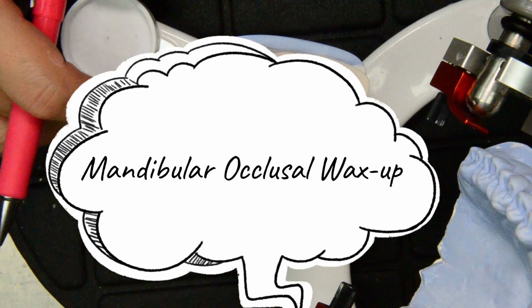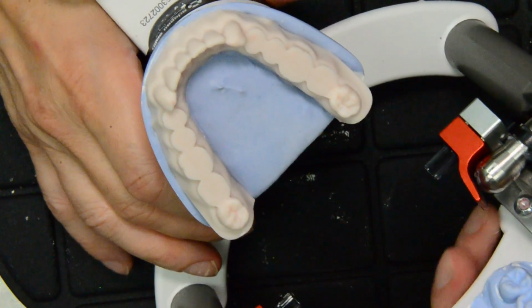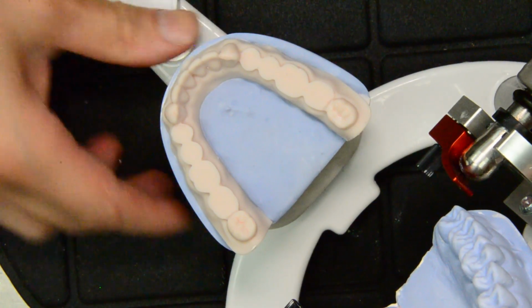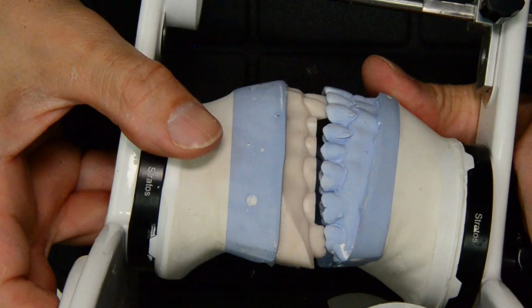Okay, our first project will be the lower mandible. As you can see here, we have the lower mandible, posterior teeth prepared down to a flat surface. So we will use this model to learn to wax the occlusal scheme for the lower posterior teeth.